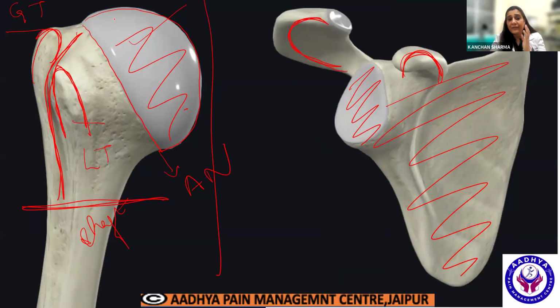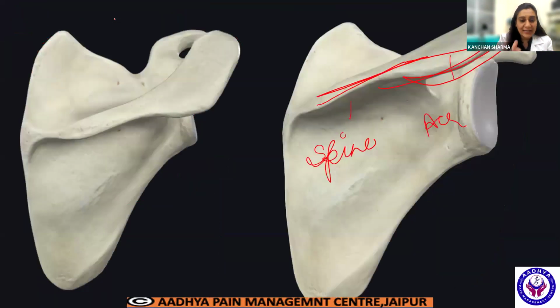These bony landmarks are very important because when you are a beginner in MSK, you should just palpate the landmarks and put your probe, and you will 101% be exactly there. Fine. That is the reason for learning all these bony things.